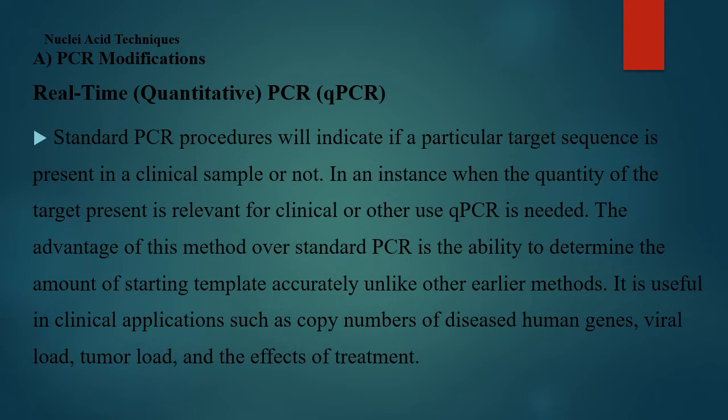So someone has hepatitis B infection, you want to know the viral load. You pick a sample from the individual, but because of the quantity of the required DNA within it that you can get, you need to amplify it using PCR. When you finish your PCR, the quantity of that gene that you've replicated is not what was originally in the sample. So in quantitative PCR, it helps you know the original quantities that you had before you started your whole PCR multiplication.